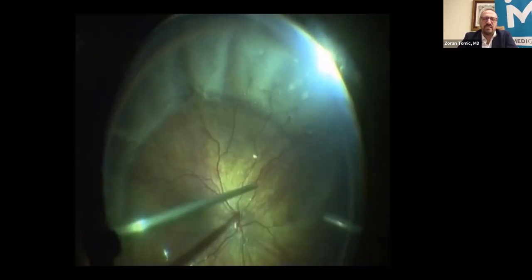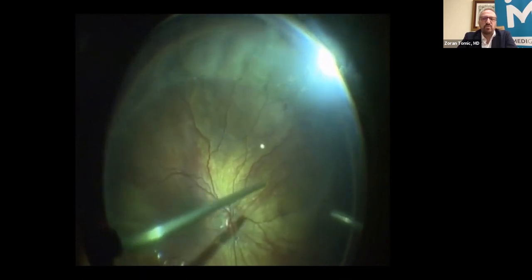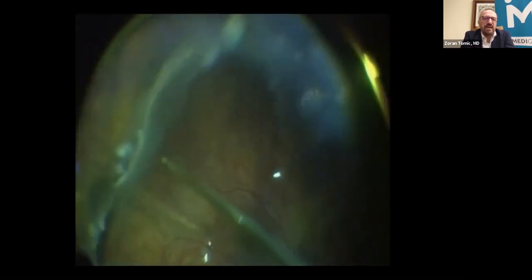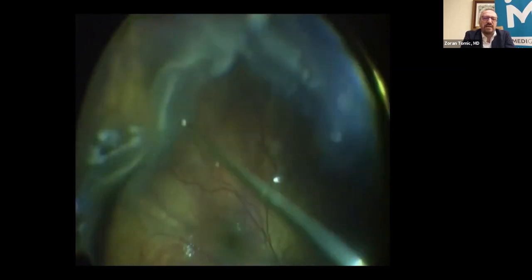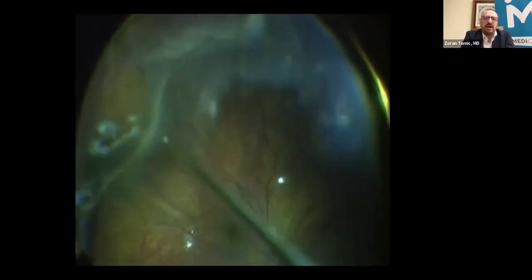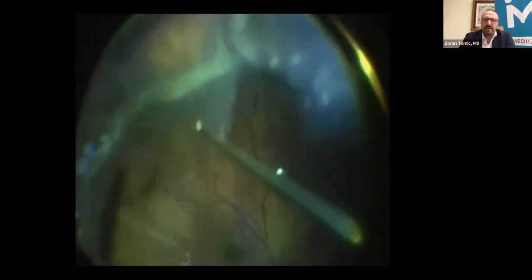In this case, since it was a pediatric case, there was an encircling band, which is used in cases like pediatric surgery, high myopic patients and inferior detachments. And then we can, under the perfluorocarbon, when you press the vitreous in the periphery, then it's easier and more controlled to do the vitreous base shaving, even under the fluid. It doesn't have to be the air, but this is one of the solutions.